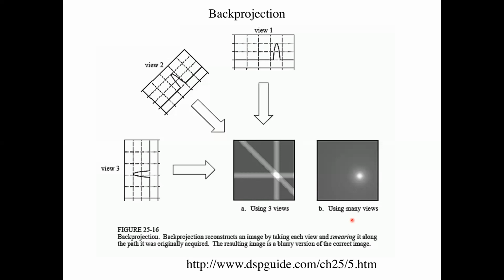But as you can see, if I plotted a profile through this object, it would not look like a profile through a disk, right? It would be some kind of smoothed out blob. And it has a very poor spatial resolution and a bad point spread function. Everything gets blurred out, right? Doing this, right? And we're going to see through a little bit of algebra what you can do to your projections to fix this blurring problem.